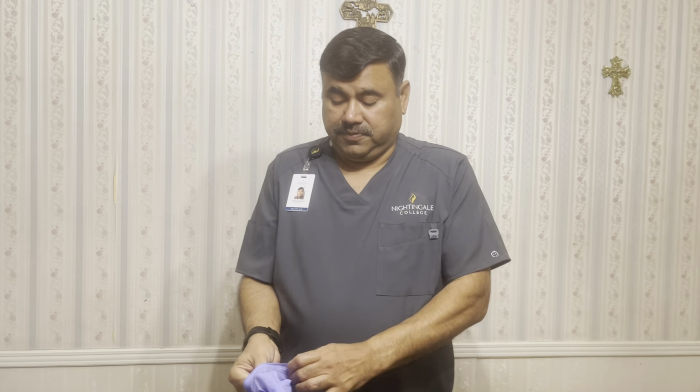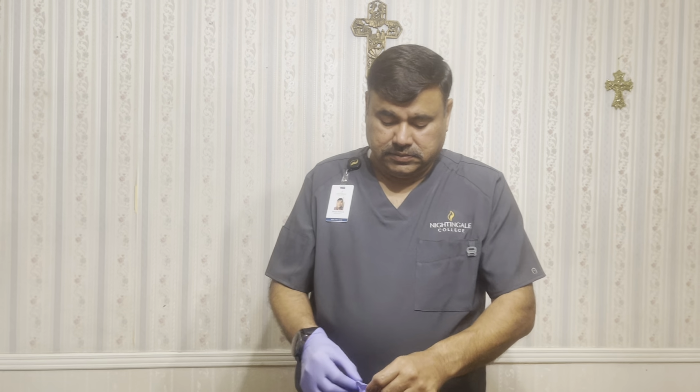So let's start. Before starting, I'll be washing my hands and putting on my gloves. Then I'll look into my physician orders and go through the 6 rights of the medication: right patient, right med, right dose, right route, right time, and right documentation.